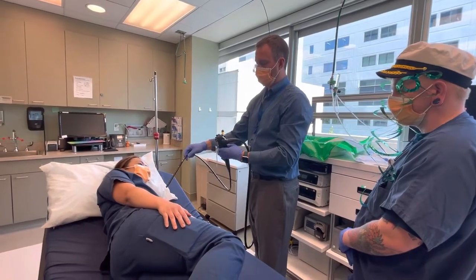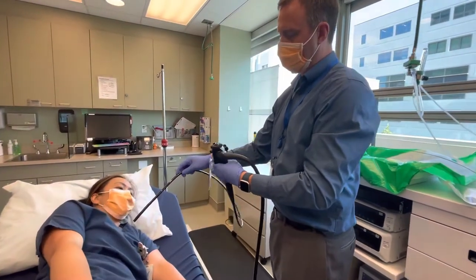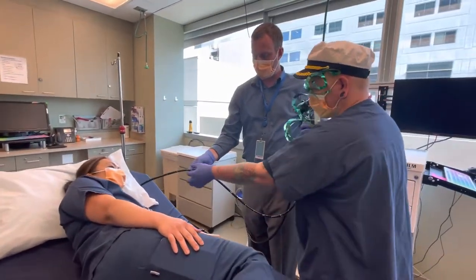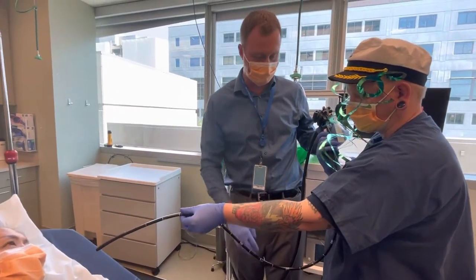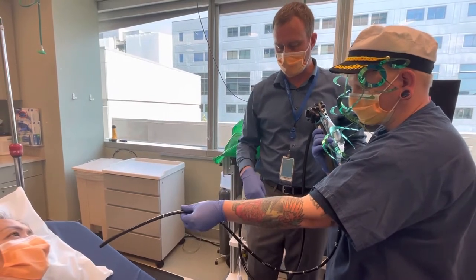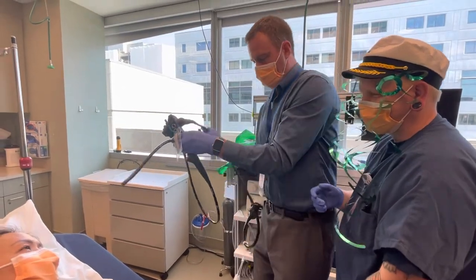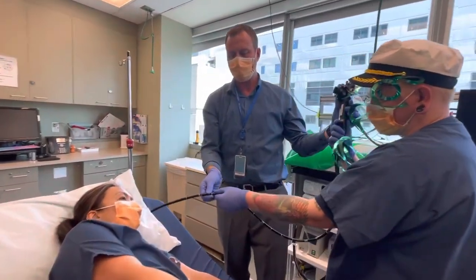Let's say it's at 25 centimeters where I keep it in the upper esophagus. What I'll do is hand it to the nurse, let them hold it here at 25 centimeters at the mouth. I'll step around the scope and pass it to them — they're holding it with two hands at the upper esophagus.